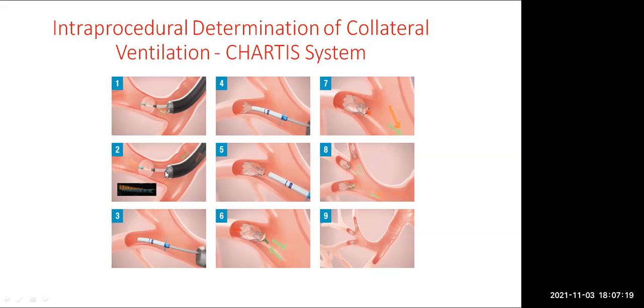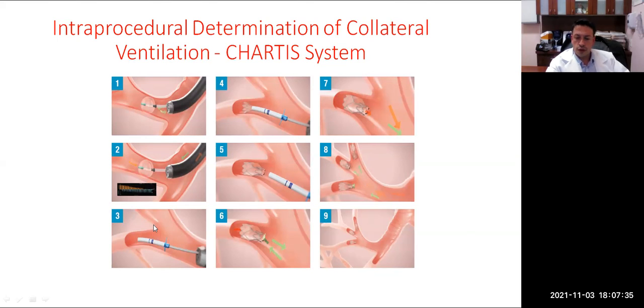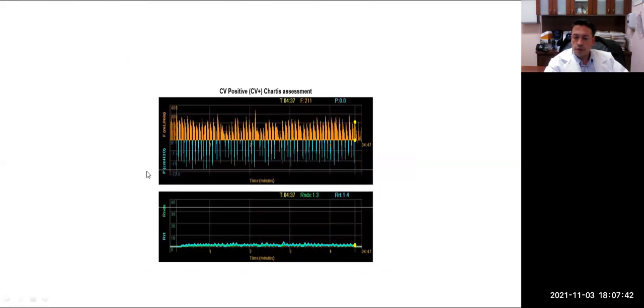I'm still not sure which flow we're talking about here if the bronchus is occluded. So this device does not inject anything into the airway. It just has a thermistor on the end of it. Correct. There's no injections of anything. It's really just a balloon with a thermistor.